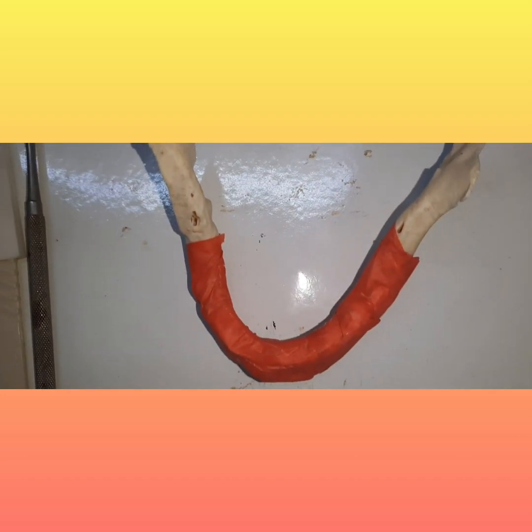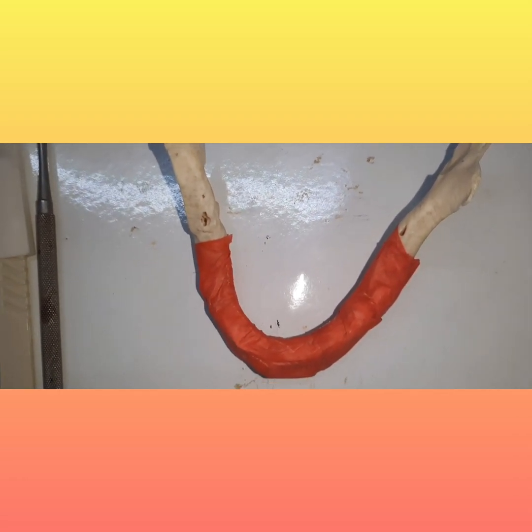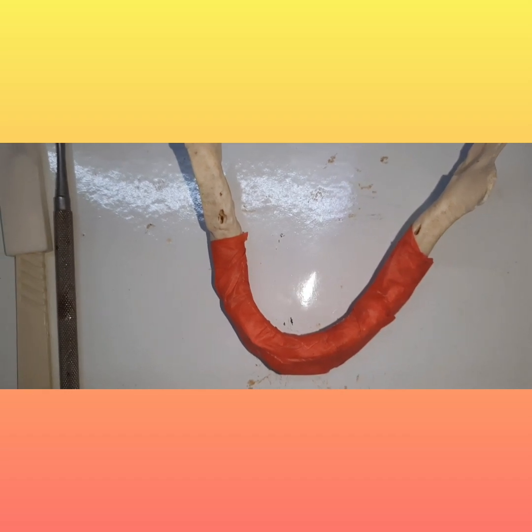and I'll be placing the implant in a 3D printed model like this, which is a patient model, and in this we are going to place one implant, and I'll just tell you about the steps which are involved in each of them.